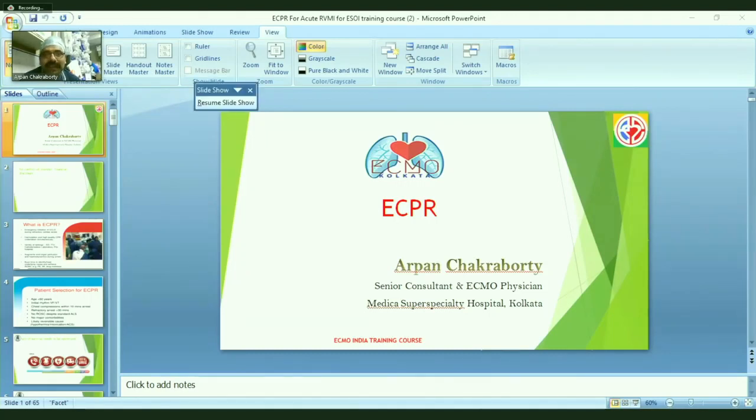Obviously we don't have any conflict of interest or financial disclosure, but I'm very much interested in the awareness of ECMO. So what is ECPR? We know ECPR is emergency initiation of ECMO during refractory cardiac arrest. And obviously the cannulation and the CPR go simultaneously, and a variety of settings can happen.